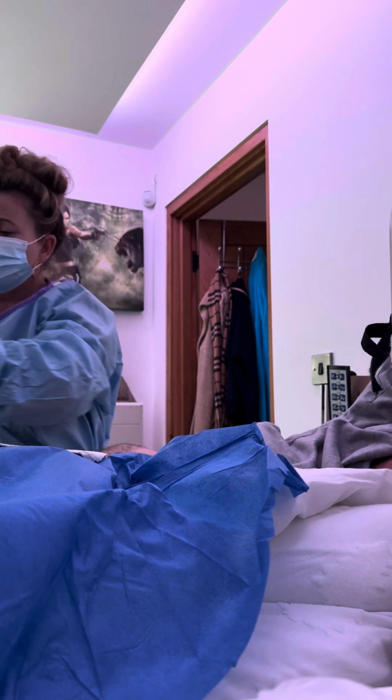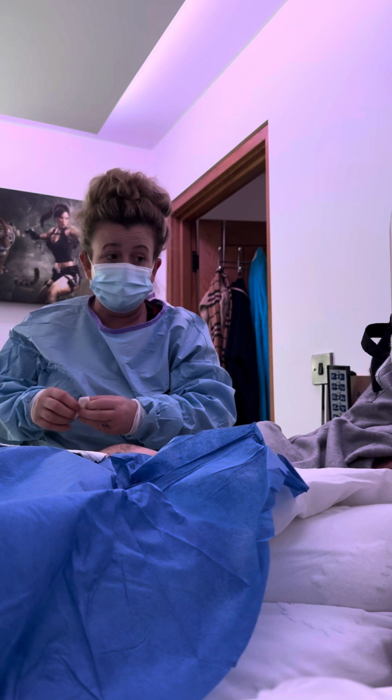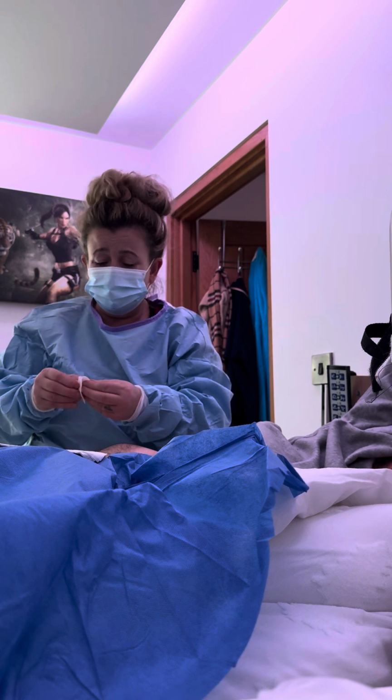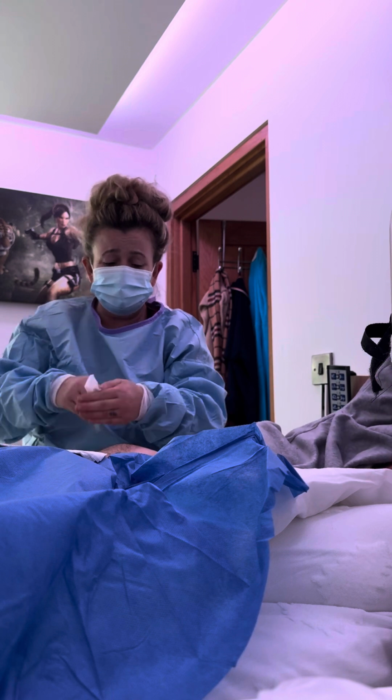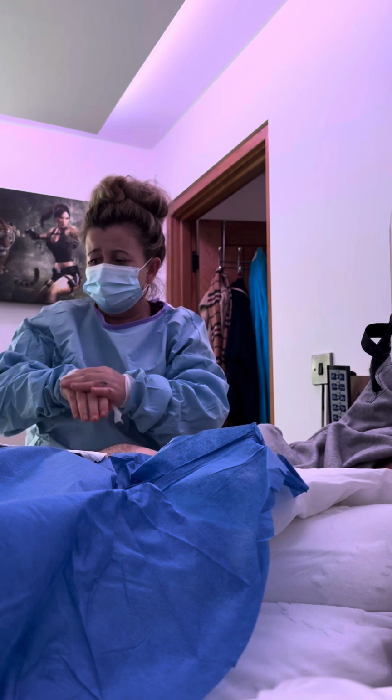Another alcohol wipe first. I'll wipe my hands because I haven't got anything else at the moment to wash my hands with. So at the end of the day, as long as my fingers and my hands are clean.